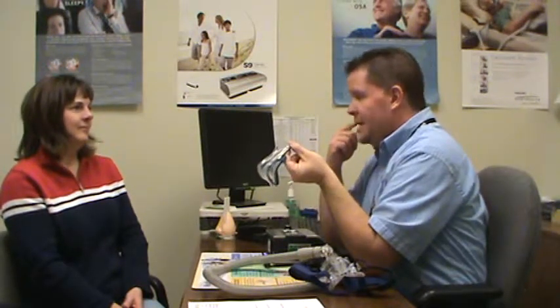Another nice thing is that insurance will allow you to replace this seal once a month. So if you get leaks in your mask, the first thing you want to do is tighten it so tight that it leaves indentations in your face and your coworkers make fun of you and everybody knows that you wear a CPAP. Don't do that. Call me and get a new seal, as insurance will replace it once a month. Do you understand? Yes. How often can you get a new seal? Once a month. How often should you clean the seal? Every day. Every day. With what?